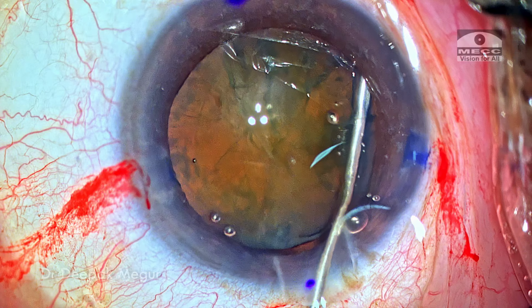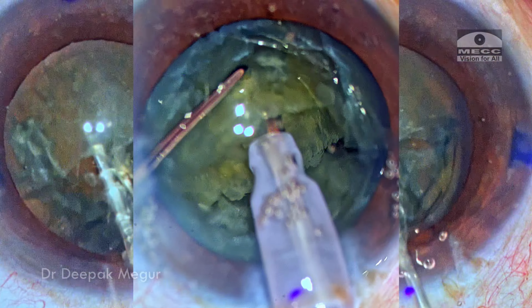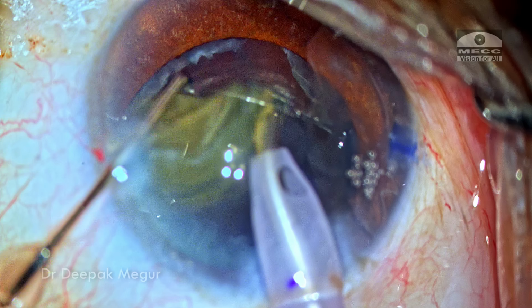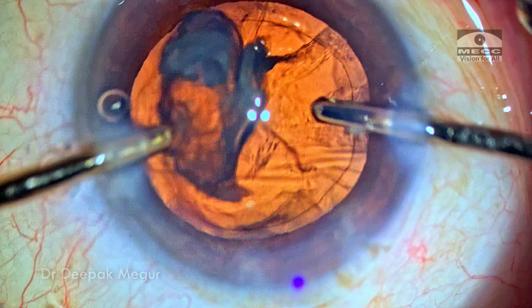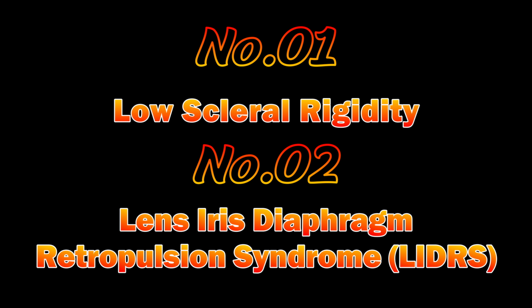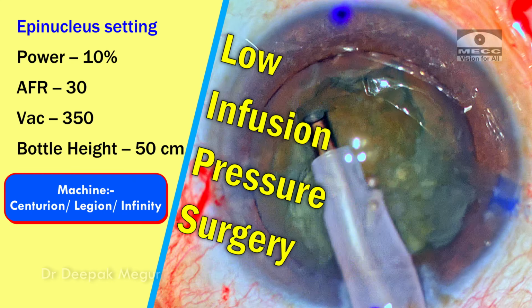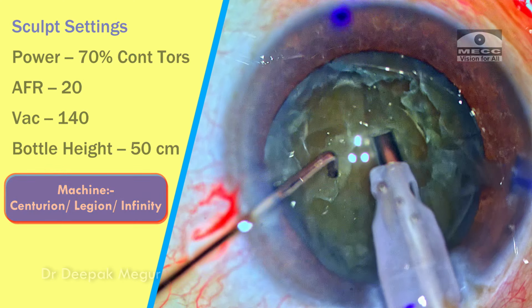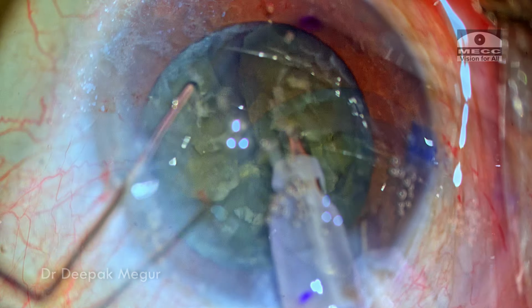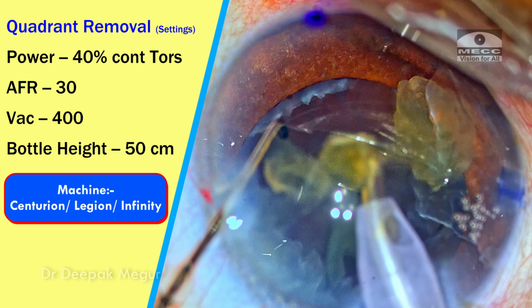To summarize, doing cataract surgery in a post-vitrectomized eye requires some amount of planning. These are some of the anticipated issues which we should be concerned about. Number one would be low scleral rigidity, lens iris diaphragm retropulsion syndrome. And to counter these things, we need to ensure that the entire procedure is done with a slightly low pressure, that is with a slightly lower bottle height, and using the right parameters to compensate for this low bottle height.